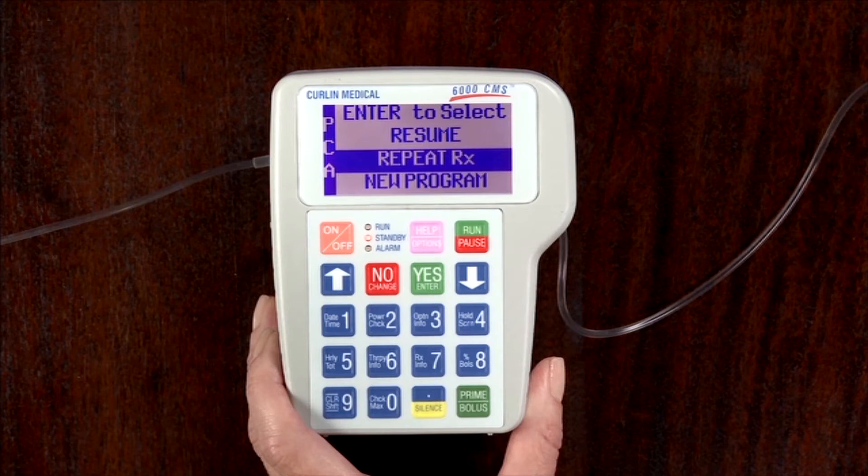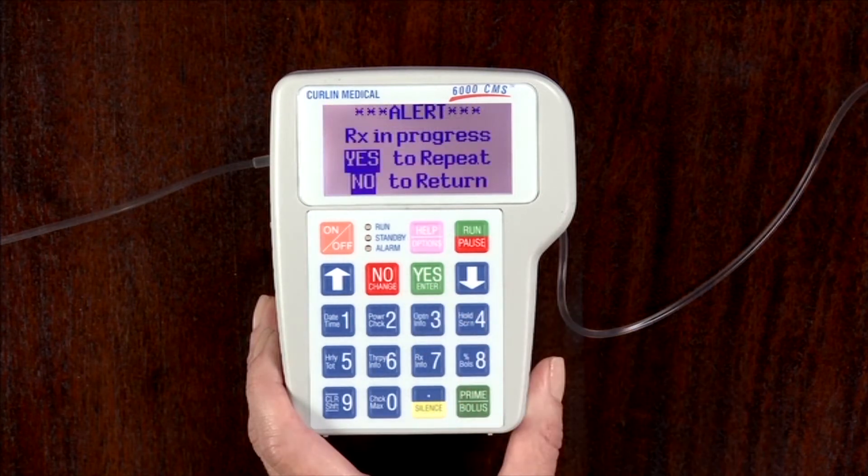Therefore, always select Repeat Rx when hanging a new bag on the same patient. This will reset the volume to be infused to its original value and reset the volume infused to zero.